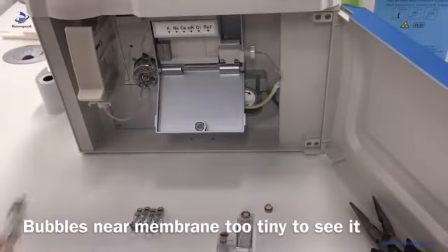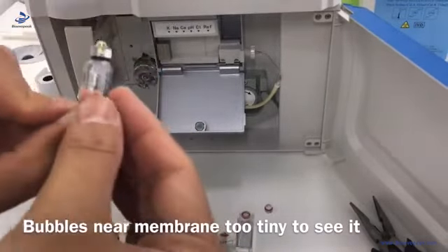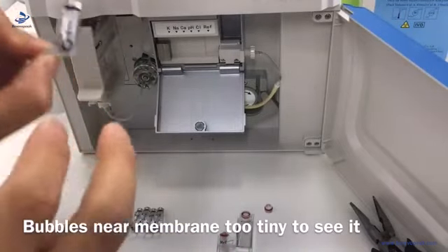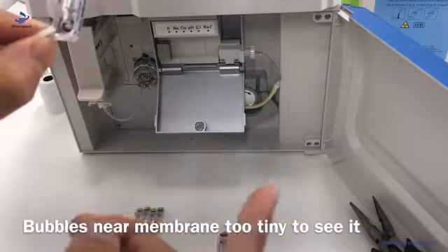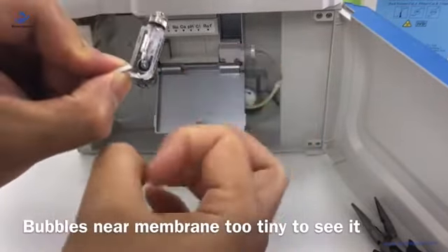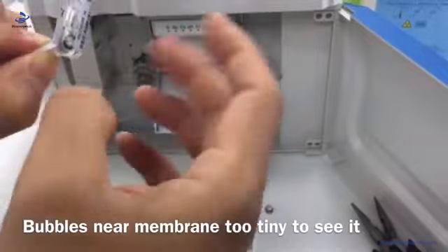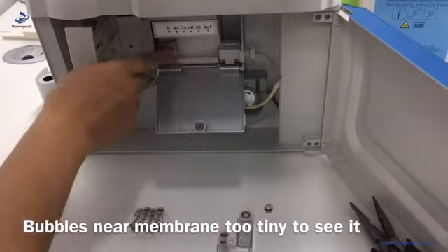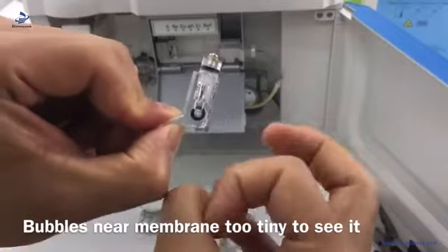Now let's do the installation for electrodes. This is the normal electrode. We hold it in this position. There are tiny bubbles inside that we can't see. We hold it and use our finger to flip the bottom of the electrode. We need to do it firmly to remove the tiny bubbles. You have to do this before installation, for each electrode.